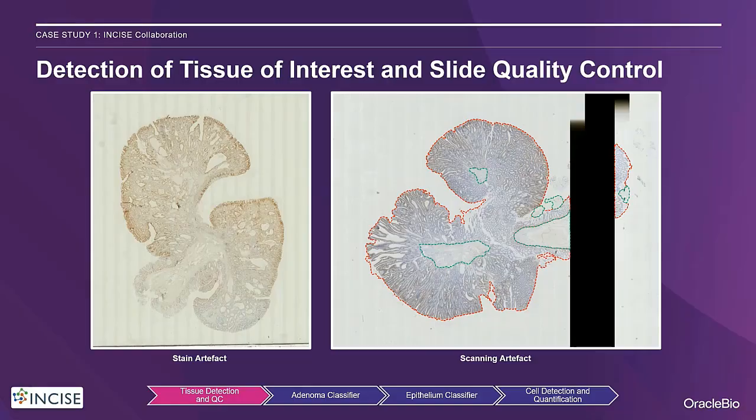Also, issues with non-uniform background illumination, for example, both within the sample and across different slides, were also tackled so that only the tissue of interest was segmented and passed on to the next step of the workflow.